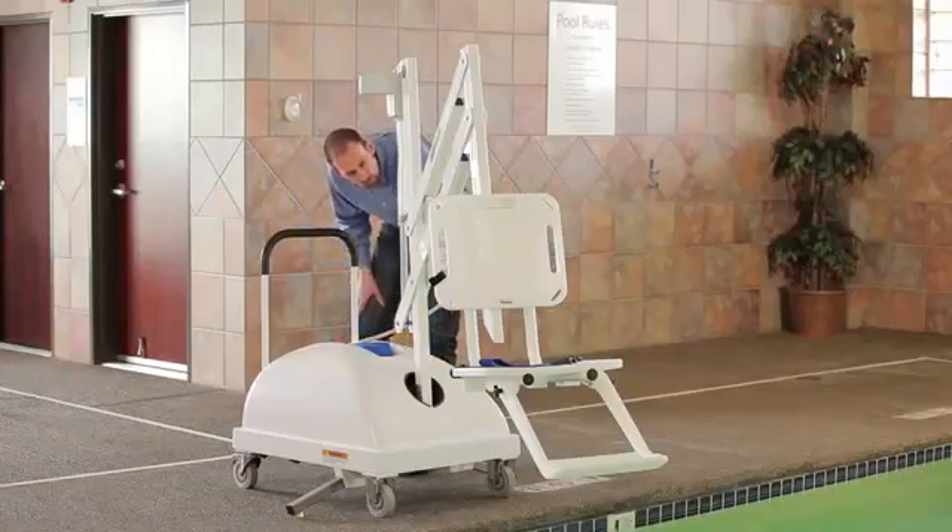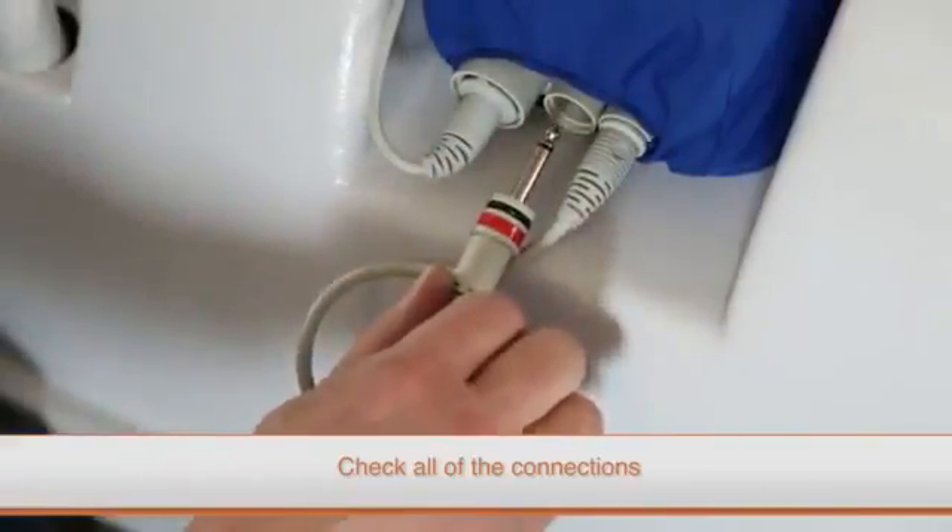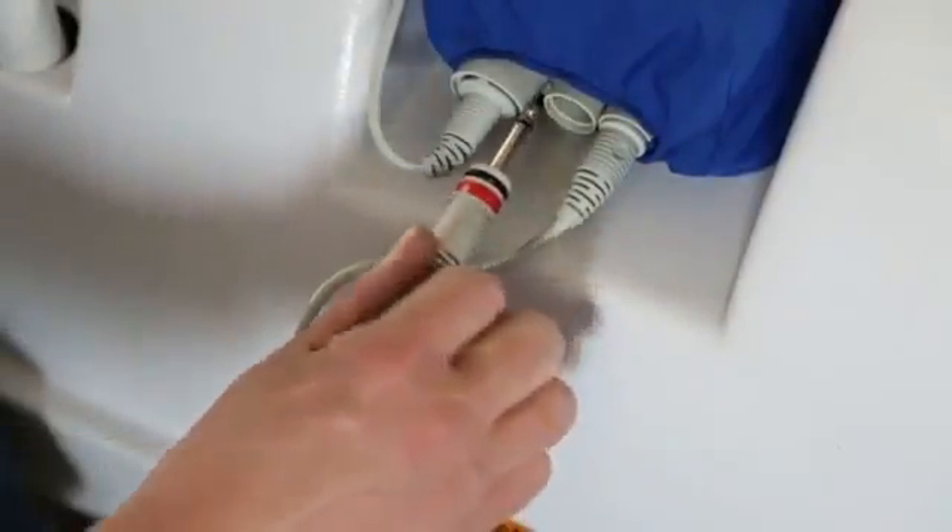If your SR Smith lift isn't functioning as it should, closely inspect the lift to ensure that everything is connected and has not been unintentionally disabled.